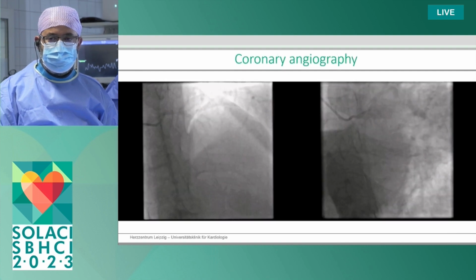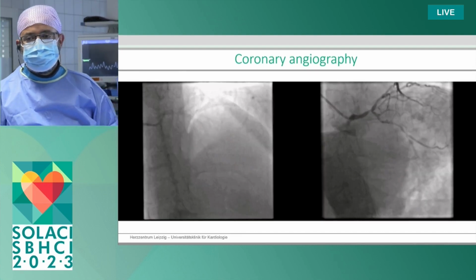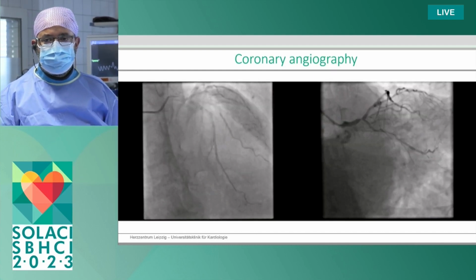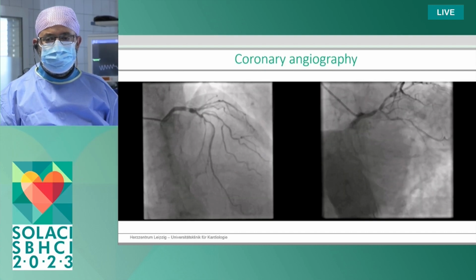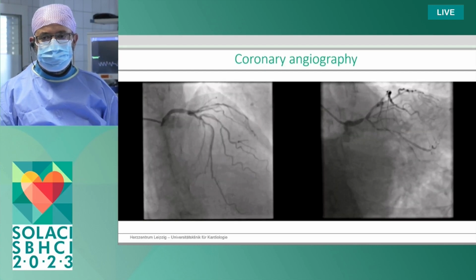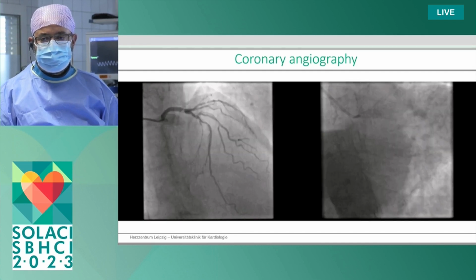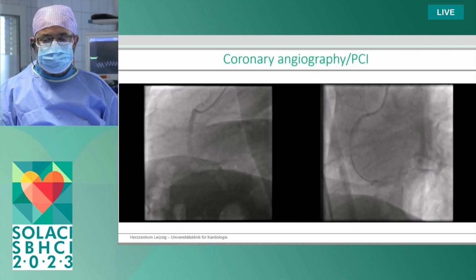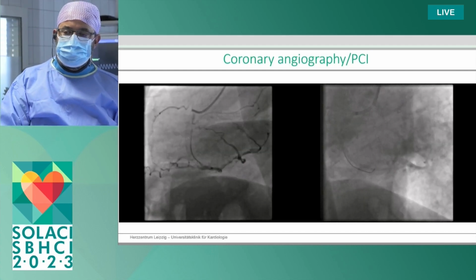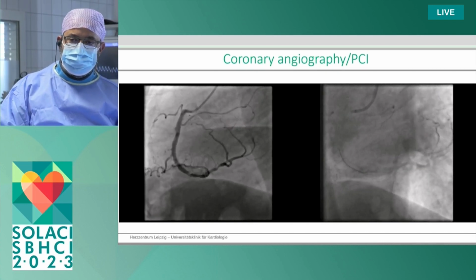We did a coronary angiogram a few weeks ago, Dimitri? 3 weeks ago. And you can see here he has a critical distal left main, heavily calcified, more or less small circumflex artery, and a long lesion, also calcified, extending into the mid-LAD. The first diagonal appears to be big, but it doesn't appear to have a lot of disease. Next slide, please. And he had the critical lesion in the distal right coronary artery as well, which was treated during the time of the coronary angiogram 3 weeks ago. So we're planning today to treat the left main.